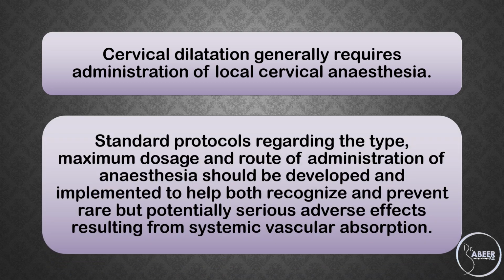Standard protocols regarding the type, maximum dosage, and route of administration of anesthesia should be developed and implemented to help both recognize and prevent rare but potentially serious adverse effects resulting from systemic vascular absorption.